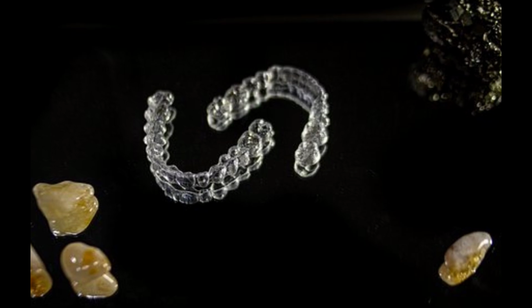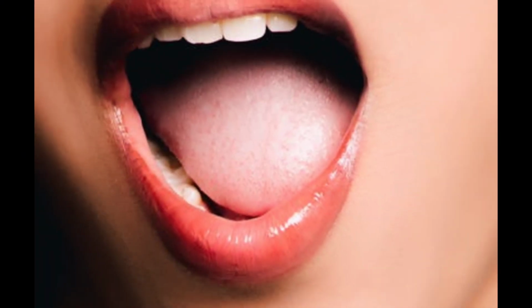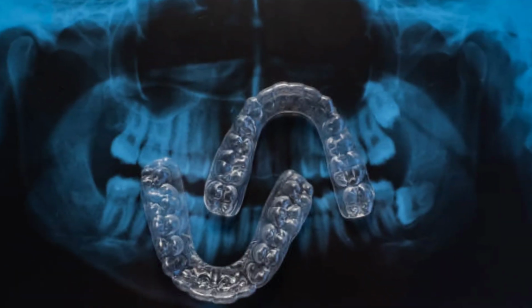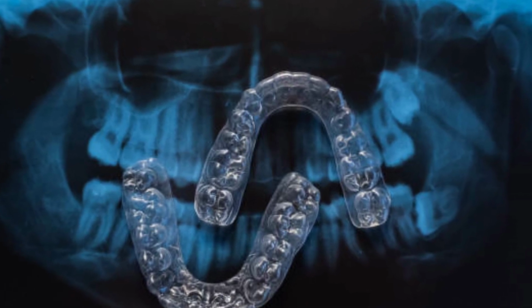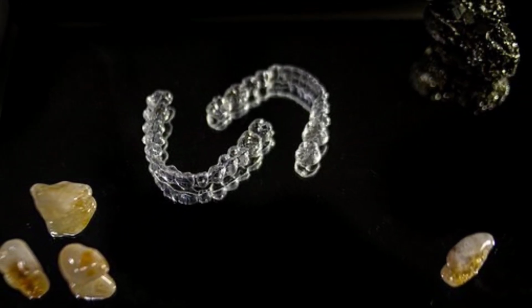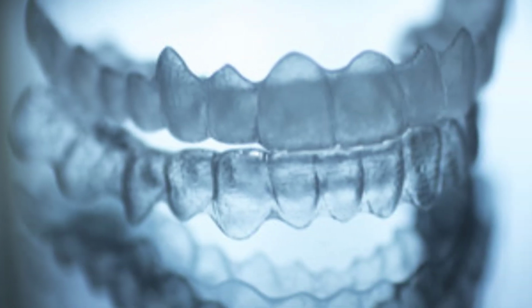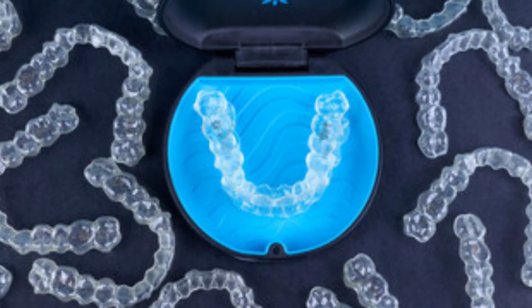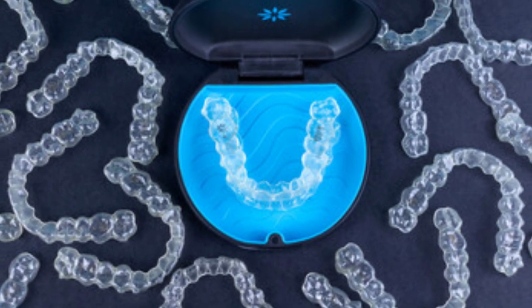Let's see how it works. Aligner trays are custom made for every patient depending on the severity of teeth misalignment. Based on the severity of malalignment, the treatment plan varies. After the proper diagnosis, and if you are an eligible candidate for using clear aligners for correction of malaligned teeth, then the next step of aligner preparation will start. Teeth impressions are made using 3D technology, then the digital models are transferred to a production facility and the aligners are made. They provide multiple sets, approximately 25 to 40 sets of aligners, for complete alignment of teeth.